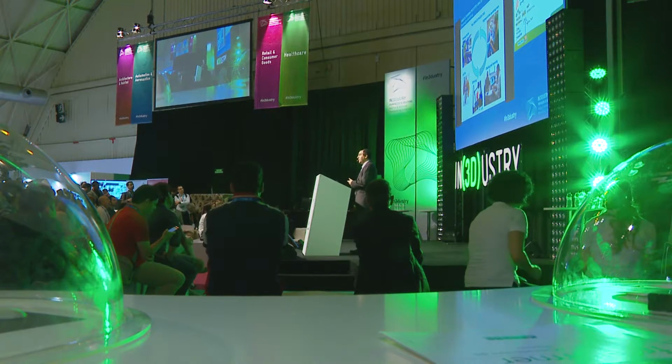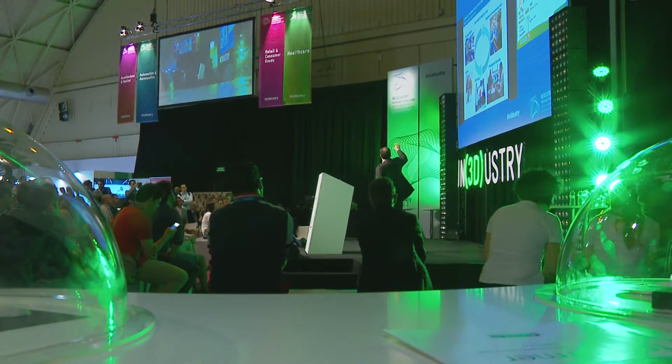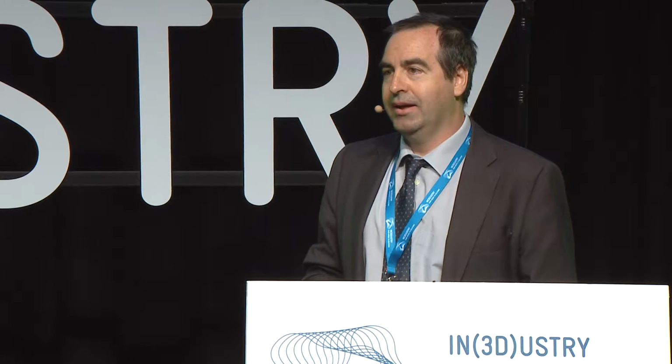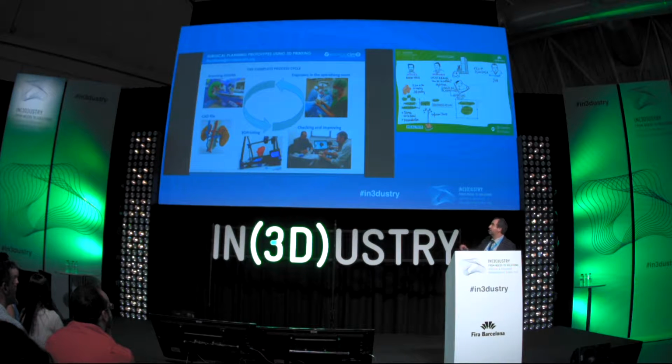I'm summing up in this slide the whole process that we use with Sant Joan de Déu. First of all, you can see that we are scanning the information, taking a DICOM in the Sant Joan de Déu facilities, and then Aleix told you how we arrive at a CAD file. He told you that arriving at this CAD file is really hard work that must be improved. In fact, most of our cost and most of our time is invested in that part, in the CAD file. Then comes the part of 3D printing.